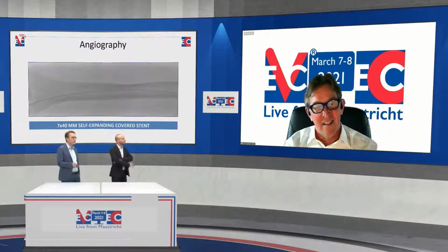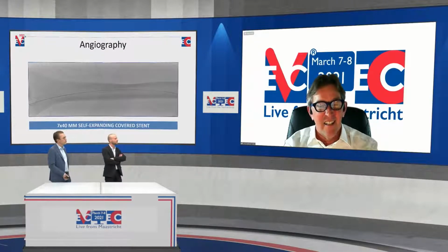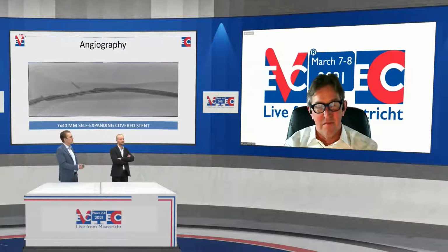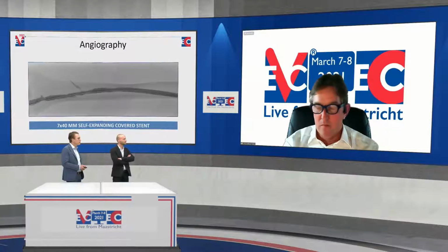I think that there's no room for bare metal stents in vascular access interventions. This is also stated in the KDOQI guidelines, and when you look at the evidence, it does not do anything better than balloon angioplasty.